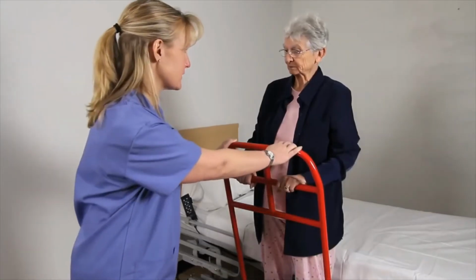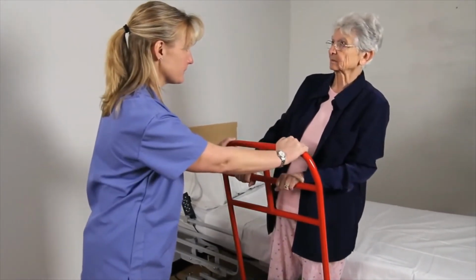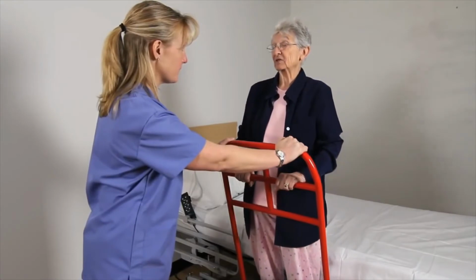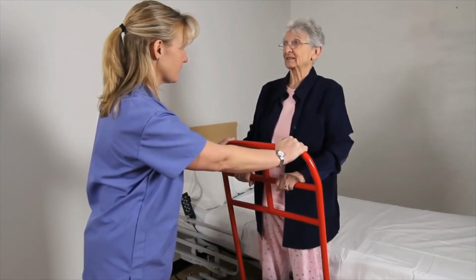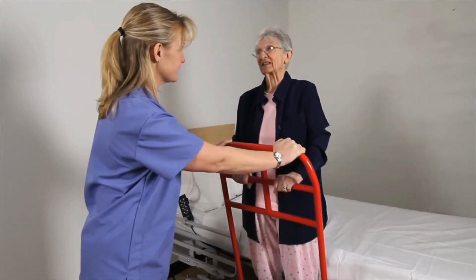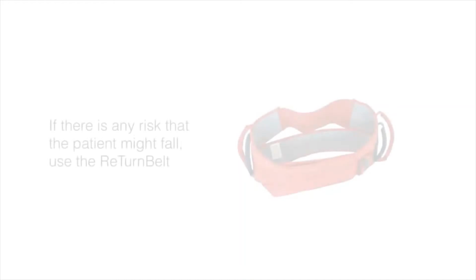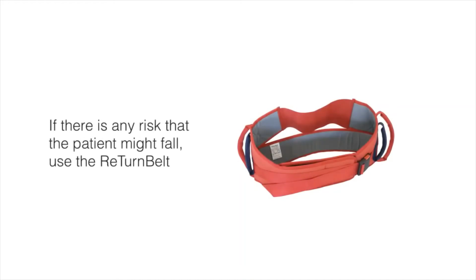When walking, you naturally lean from side to side to be able to move your feet one at a time. This test assesses balance and capability to lean sideways when lifting your feet to walk. Ask the patient to lean from side to side. If this is okay, go to the next test for lifting heels. If there is any risk that the patient might fall while leaning sideways to perform the previous test, use the Return belt for safety and support.